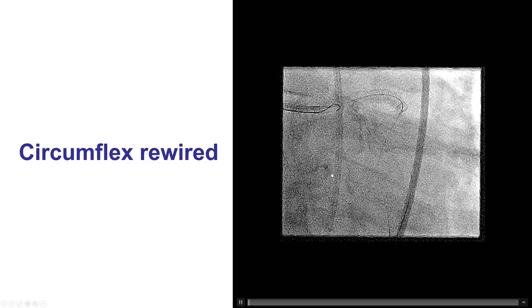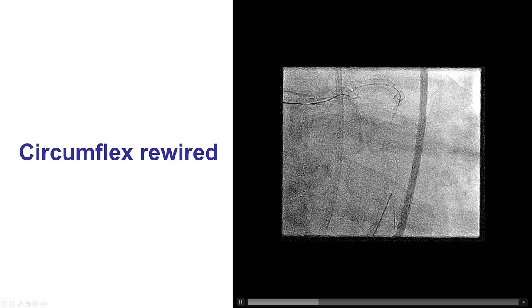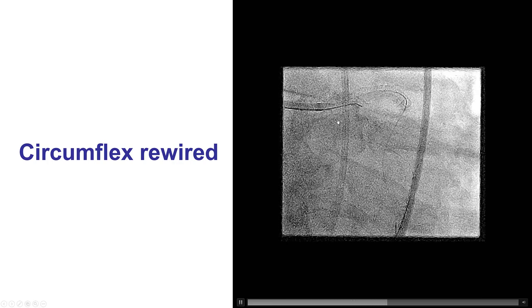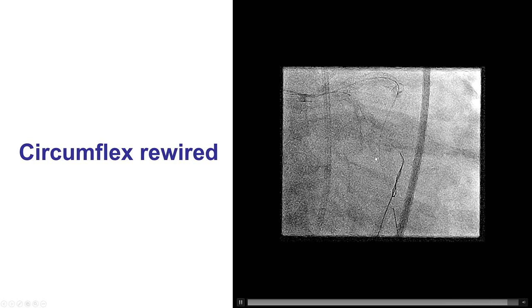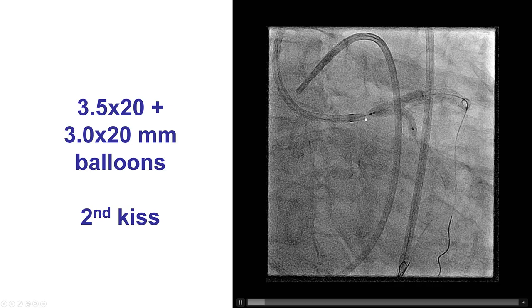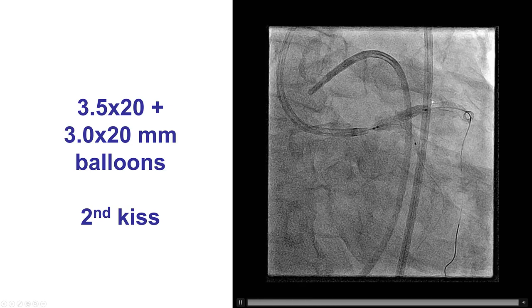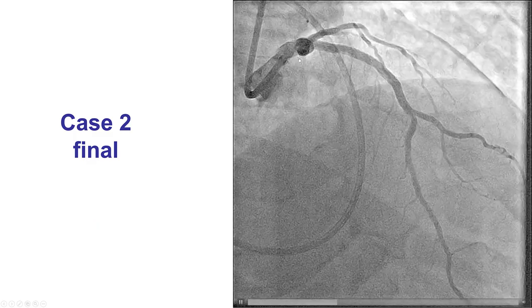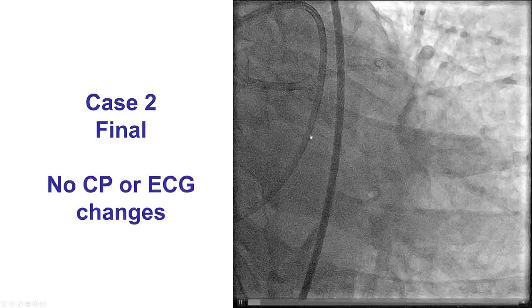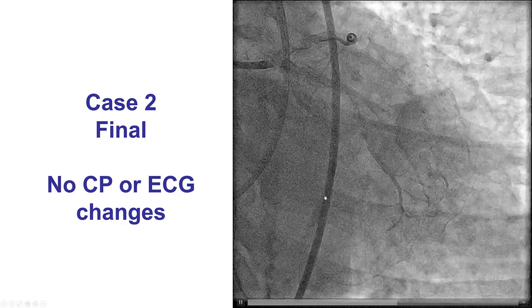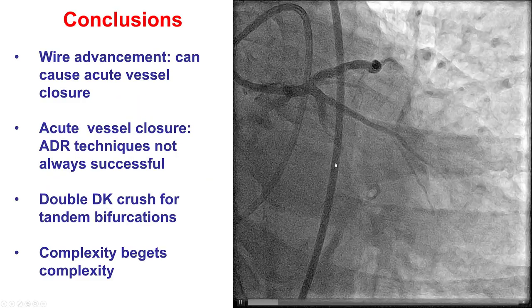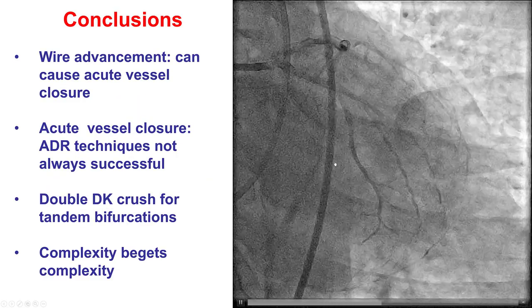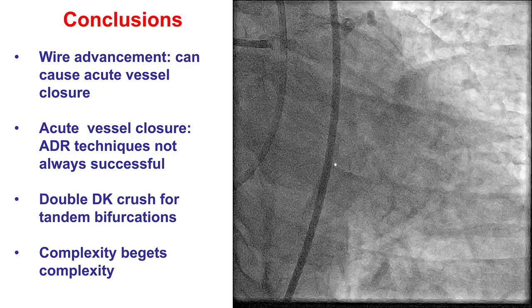After proximal optimization, we rewired into the circumflex, which was a little tricky. The second rewiring is best done through a distal strut, as happened in this case. We then did the second kissing balloon inflation for the left main bifurcation, with a 3.5 mm balloon into the LAD and a 3.0 mm balloon into the circumflex. This provided a nice result in the left main and LAD, as well as the proximal circumflex and obtuse marginal branch. We still had very poor flow into the distal circumflex, but the patient was feeling well without chest pain or EKG changes, so we decided to let it be. He had an uneventful post-procedural course, with a plan to return for a repeat procedure in the circumflex.